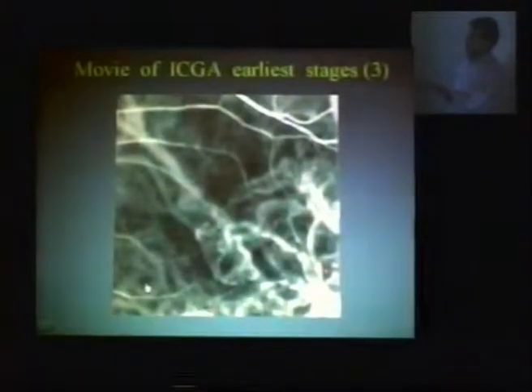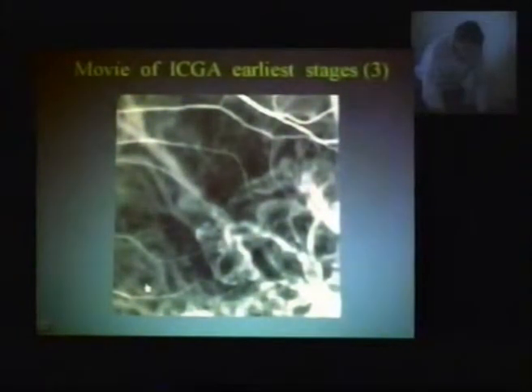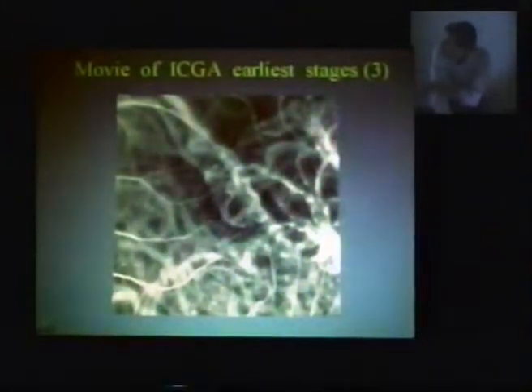This is the CNV. This is not normal choroidal vessels. These are the choroidal vessels. This is in focus anterior. And that is being fed from over there. Okay, and that is the second part of it. But because of patient movement, I cannot get two parts inside, but I see they start here and they start there. Okay. Now you can see here both parts.